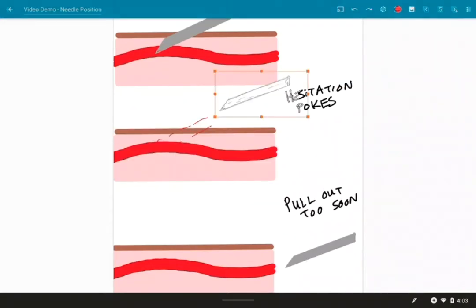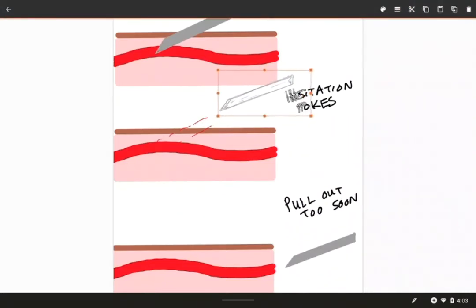Don't do hesitation pokes. Be confident when you're putting that needle in, get a half inch away, put it in there fast and hold it there. And if you're not getting blood, once the needle's there, you can pull it out a little bit or push it in a little bit, but that's it.